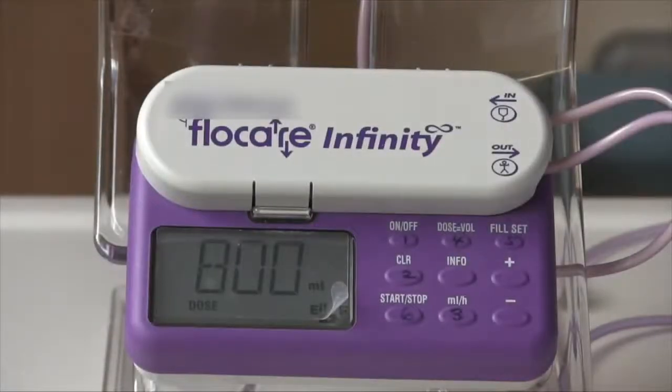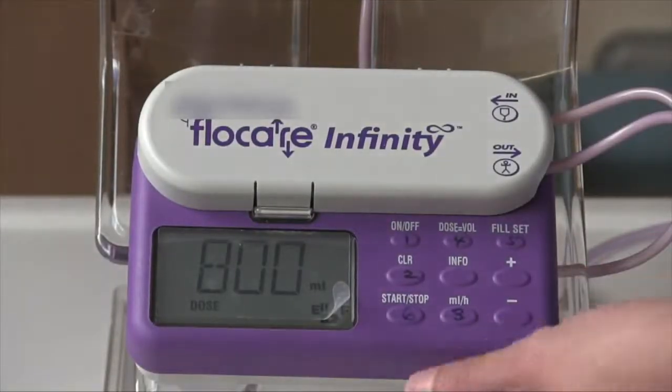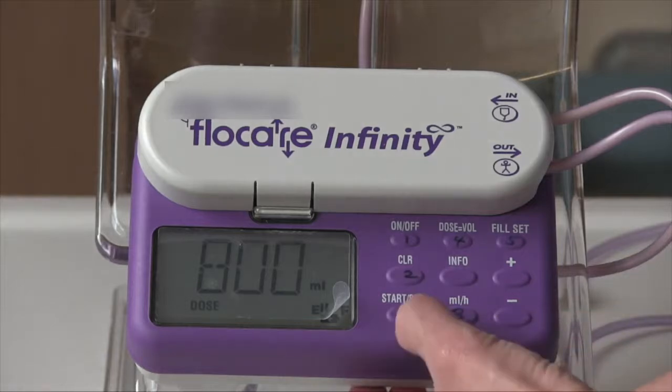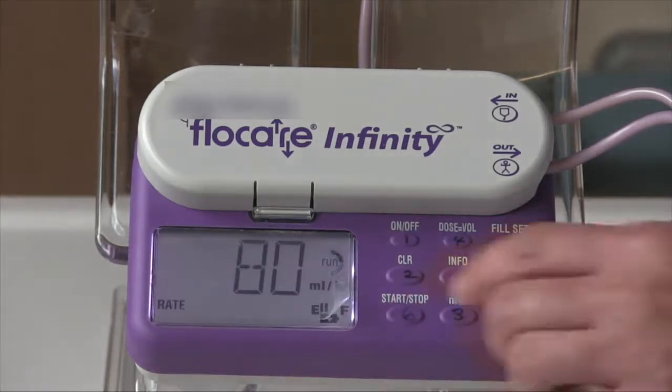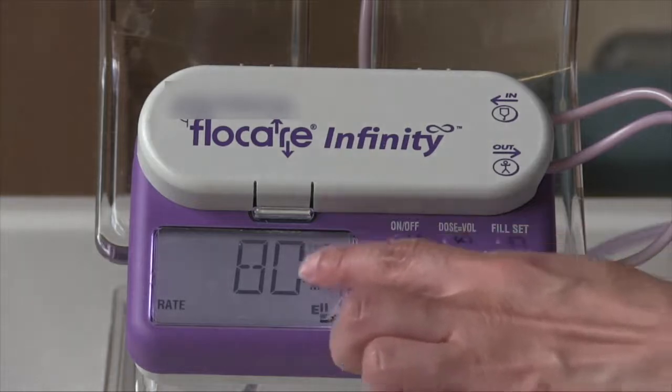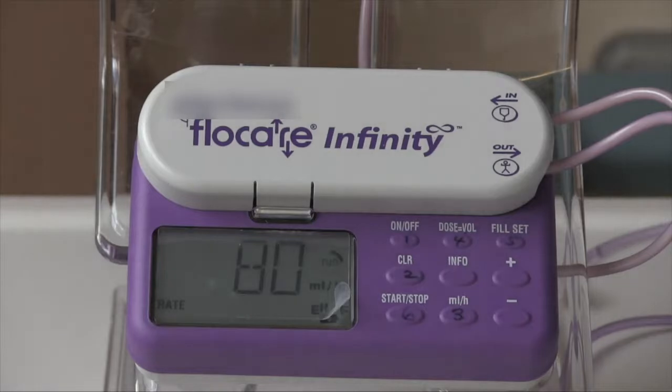Once you've attached the end of your giving set to your feeding tube, you can now run your feed by pressing the start-stop button here. So you'll hear a beep, and you'll see there's a run circle which indicates that the feed is going. It will deliver a few drops at a time, so it's normal for the machine to pause.